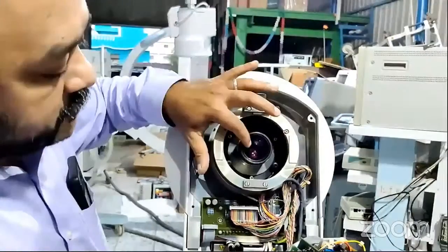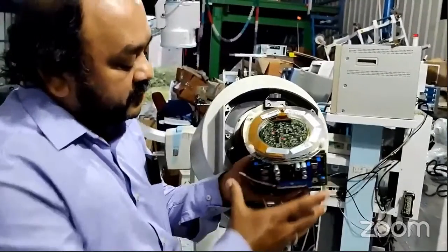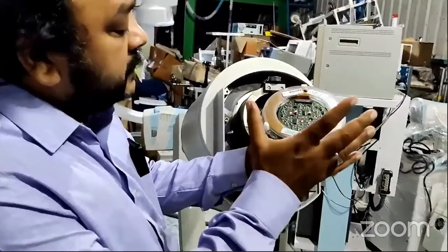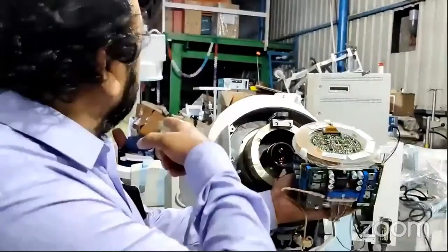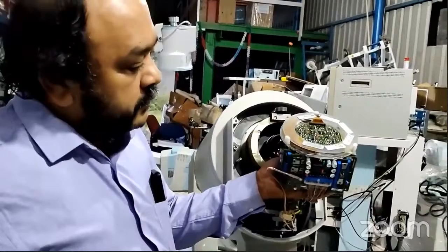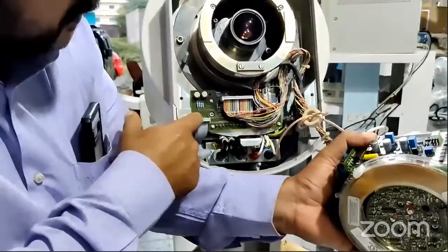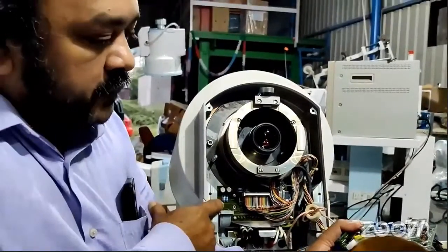So the camera will absorb the image, and after that it will do all the digital processing. Then the signal will be transmitted through the video cable to the console. Okay. This is a camera. See here, this is the high voltage power supply. This is all electronic circuit, which will deliver the voltage.